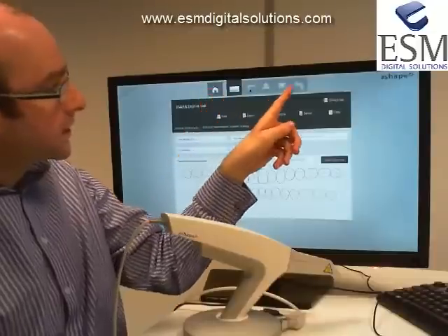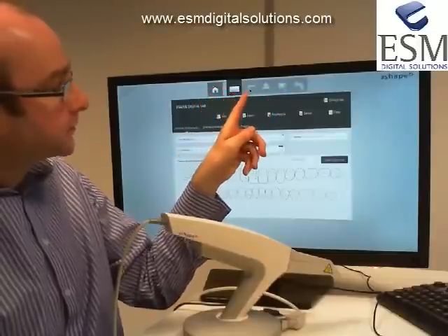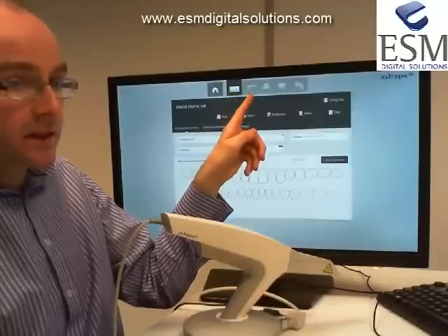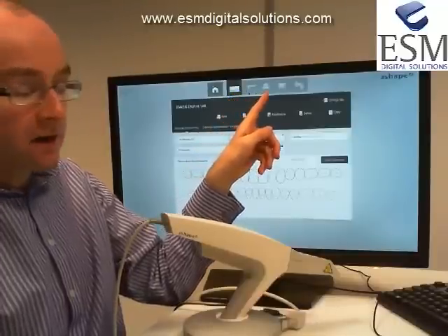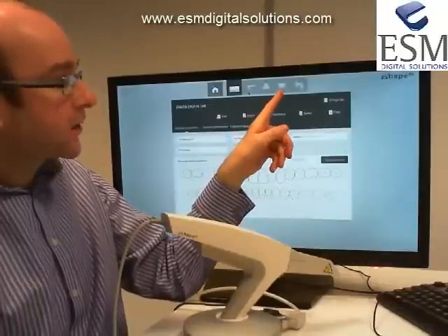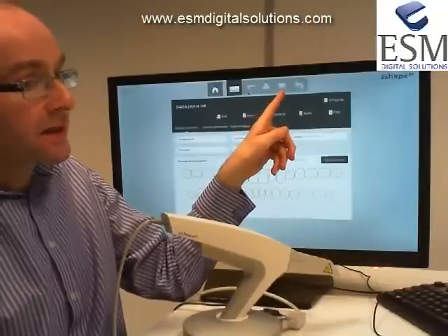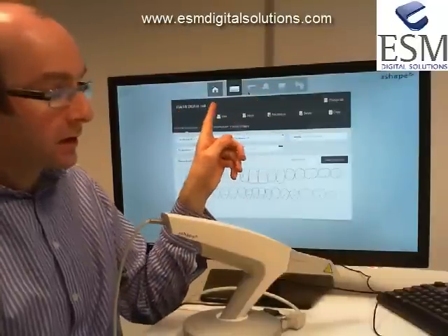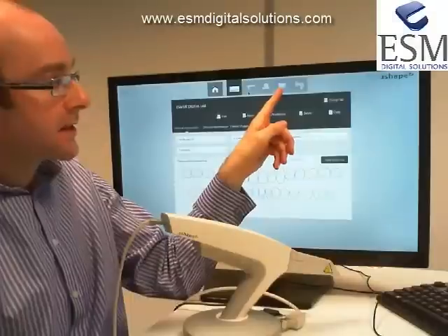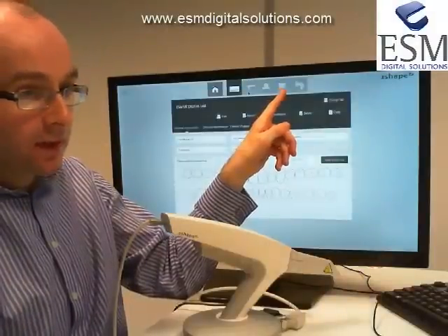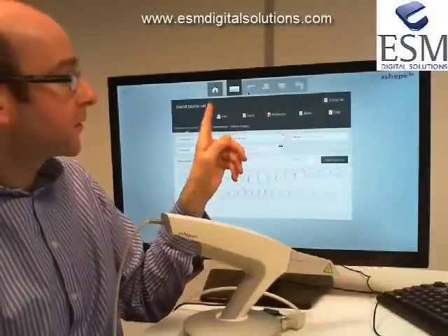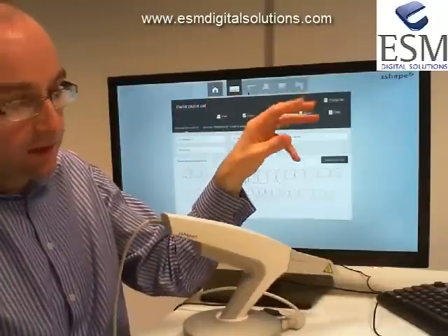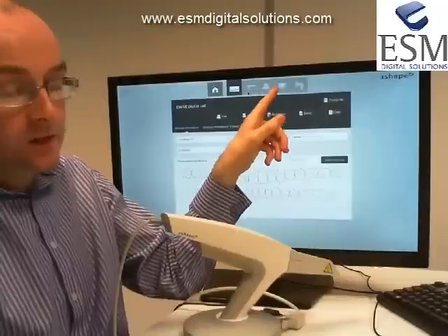On the top row we have our main workflow. The first stage is to create the order, second stage is to create the scan, third stage is to carry out some analysis if required, and then to send. Where the data goes depends on which lab you've chosen. If you've chosen your internal practice lab, when we hit send the data will go into our ortho analyzer database. If we've selected an external lab, when we hit send the data will go straight out through the communicate platform to that lab.